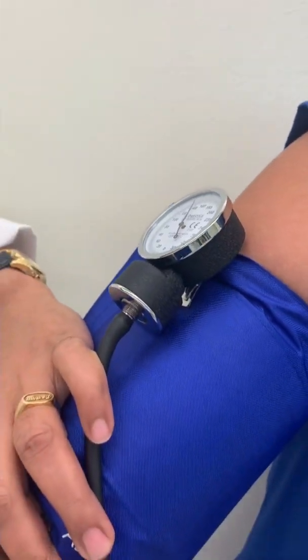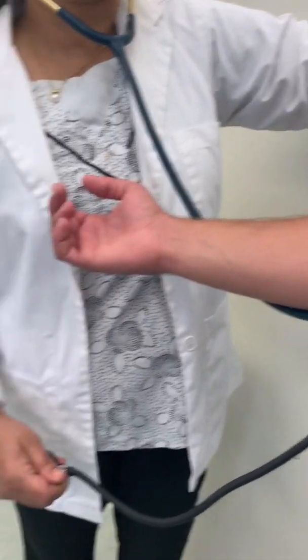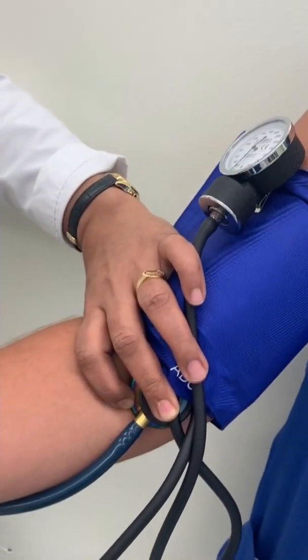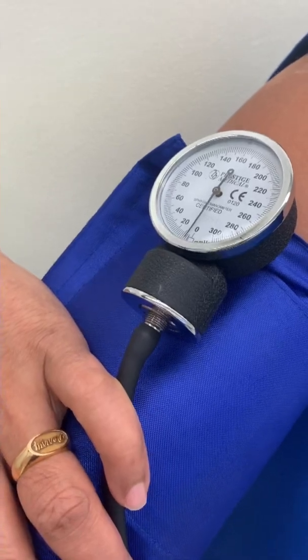I release the knob now, slowly. I hear a sound at 120 — that's the systolic — and that sound disappears at 80 — that's the diastolic.